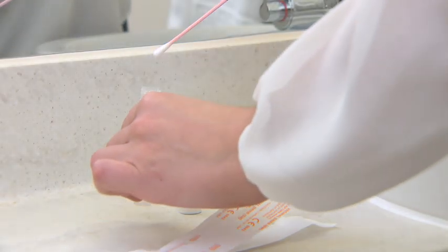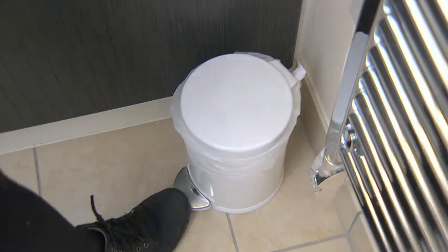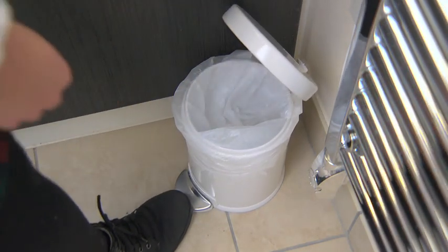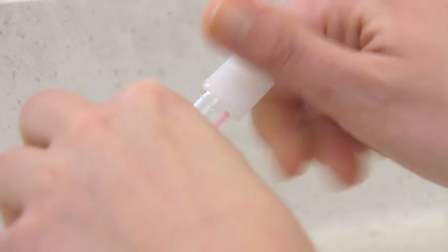Immediately place the cotton bud swab into the sample tube. Carefully break the swab shaft against the side of the tube at the score line and discard the top portion of the swab shaft. Screw the lid back onto the tube tightly, being careful not to pierce the foil cap of the lid.